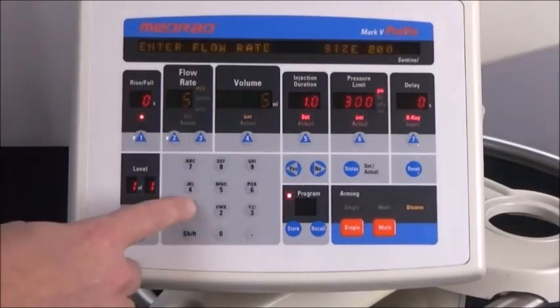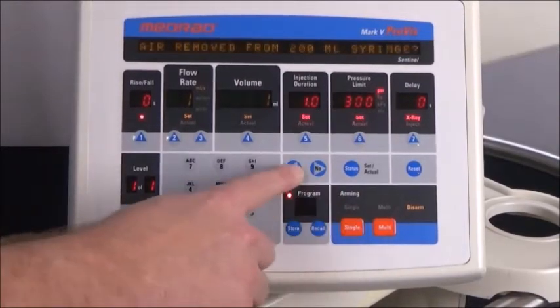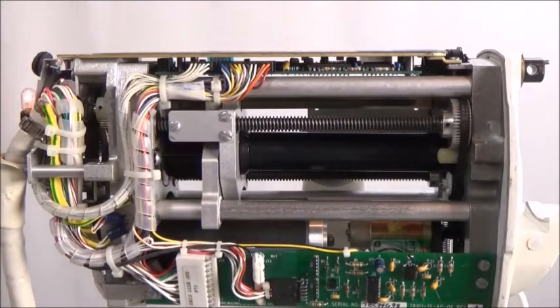Then program a flow rate of 1 milliliter per second, a volume of 1 milliliter, and a pressure of 300 psi. Then single arm the injector. The MS plate will travel up the worm gears, nearly touching the plunger plate and spreading the lubricant.